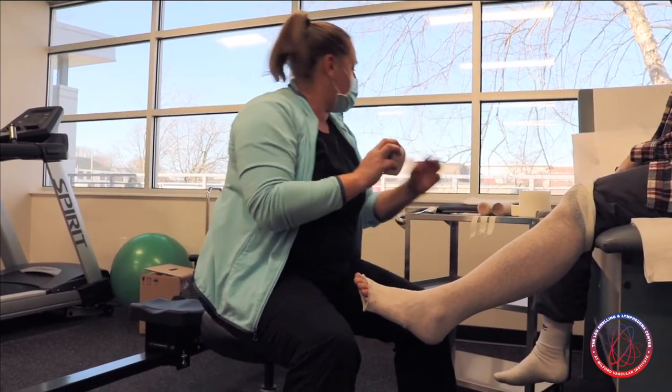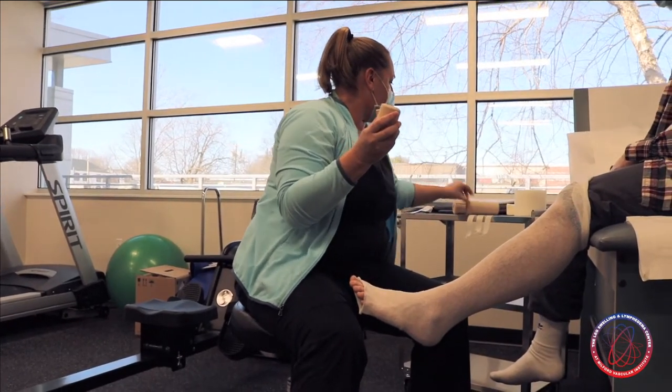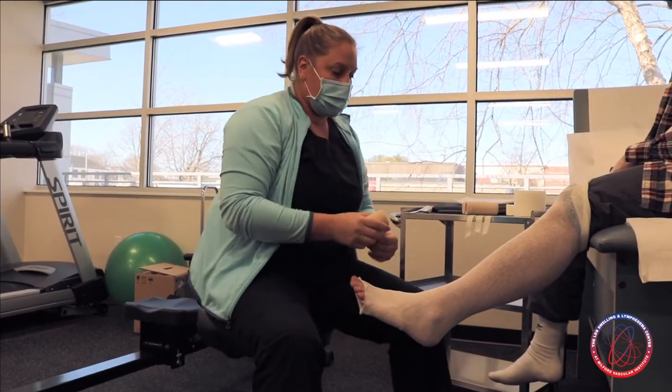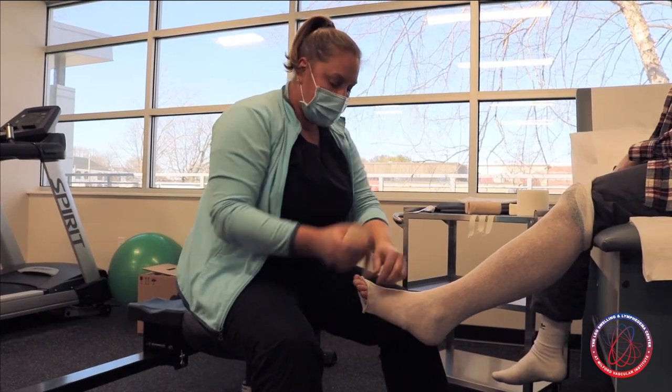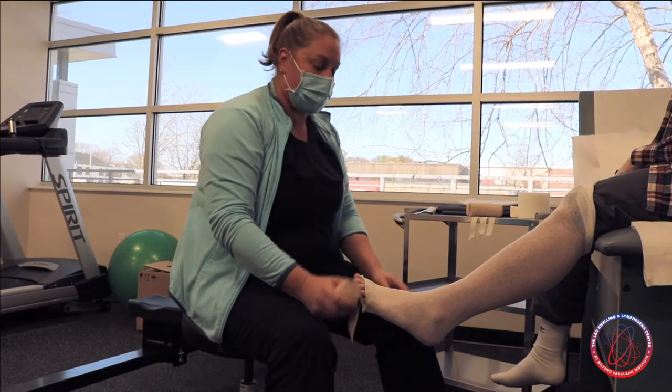We have three different sizes that we're going to use. We start with the smallest and work our way up to the largest. The reason we do that is to create what's called a compression or pressure gradient.